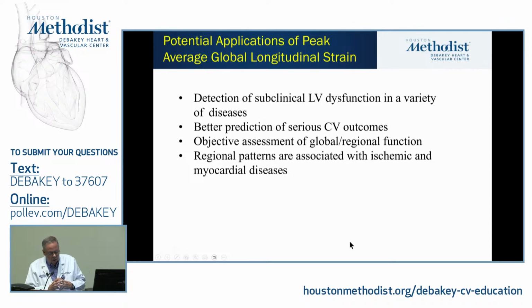So where are we now? Well, clearly we're detecting subclinical dysfunction in a lot of different diseases.